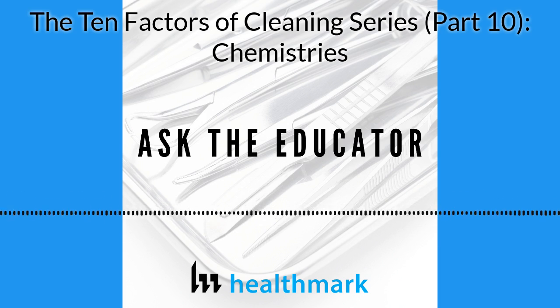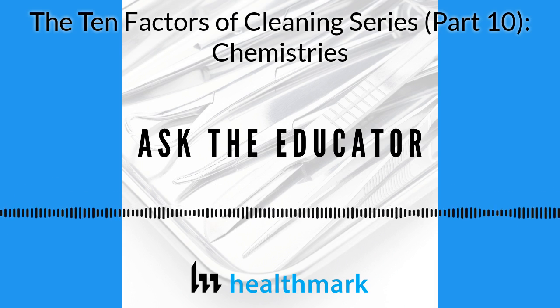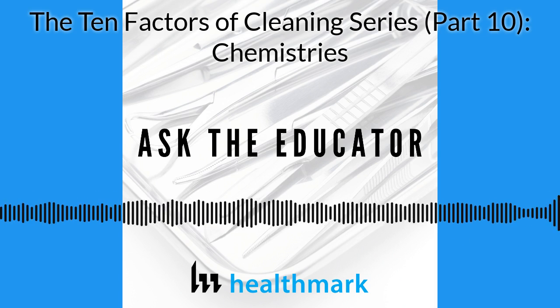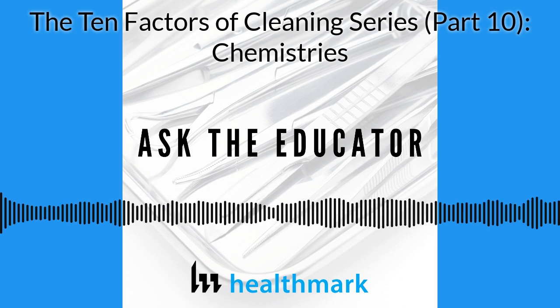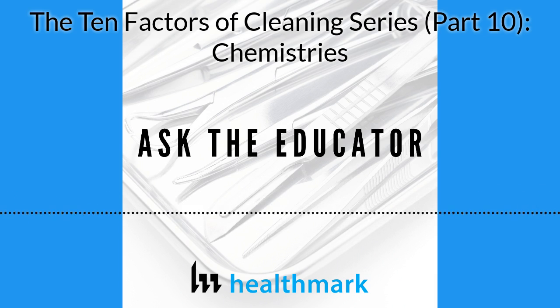And what I'd like the audience to realize is that sometimes there are detergents or maybe other solutions out there that are tempting to use on instrumentation, especially with these different soils, that you have to be careful of. I remember one of our staff found something that actually worked to loosen up that Dermabond glue off of the instruments.